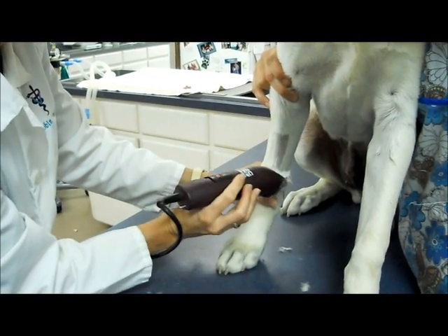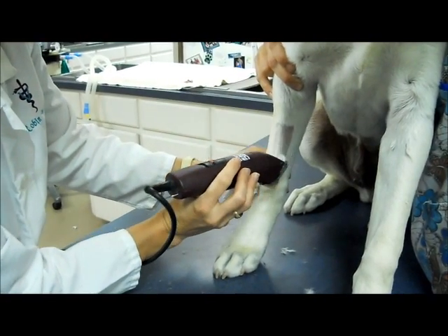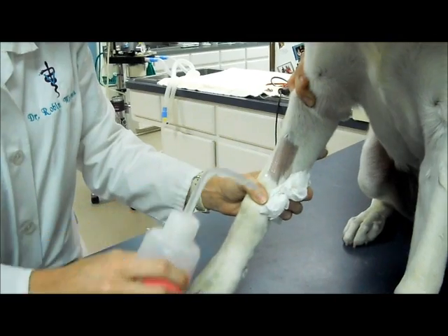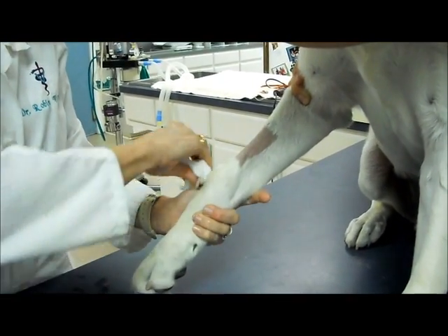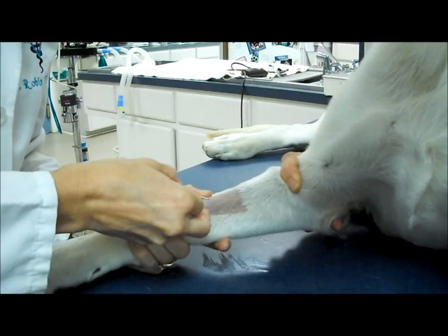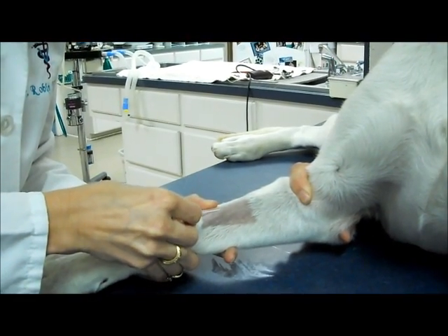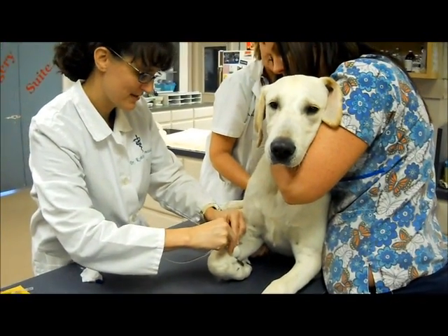An IV catheter is then inserted and IV fluids administered throughout the day. Your pet is then allowed to rest in his or her cage for a few minutes. Fluids are an added safety measure for your pet during surgery. They help to keep your pet's blood pressure stable during anesthesia and help your pet's body clear the administered drugs from their system. In addition, the IV catheter provides easy access to a vein should an emergency occur during surgery.